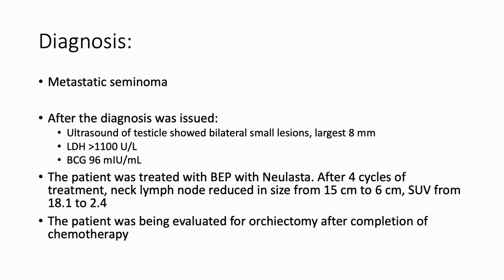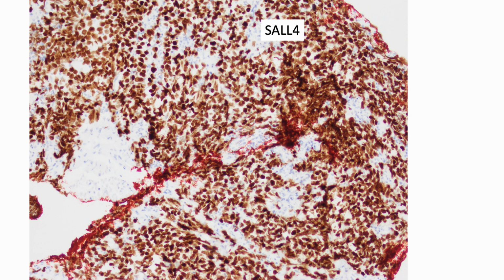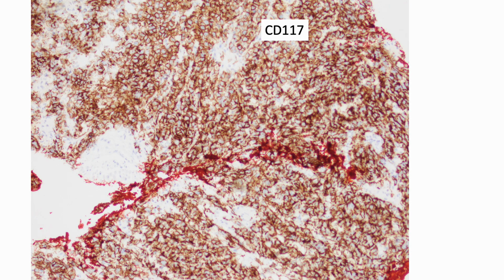The patient was treated accordingly and showed an excellent clinical response. The neck lymph node decreased from 15 cm to 6 cm after therapy. Retrospective staining of the original neck lymph node biopsy confirmed the diagnosis. Here we can see that the tumor cells are diffusely positive for OCT3/4, also diffusely positive for SALL4. CD117 is also positive. This confirmed that the tumor was indeed metastatic seminoma, not carcinoma.